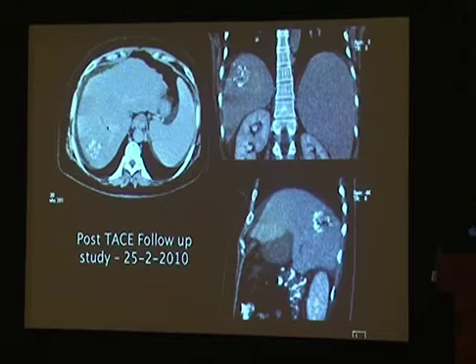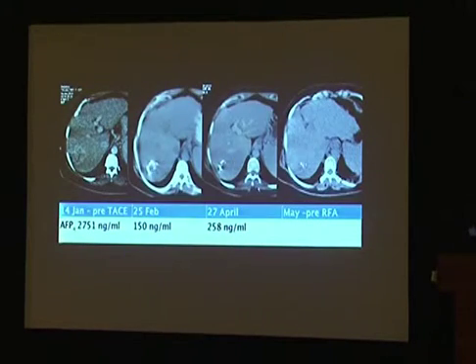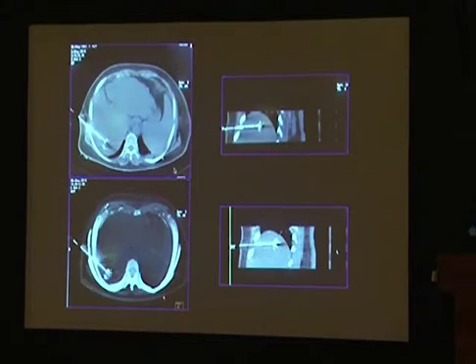We initially performed a transarterial chemoembolization in this patient, and on subsequent follow-up, what we found was the alpha-fetoprotein, which was raised initially, had significantly dropped to almost 150, and then however on subsequent follow-up, there was a rising trend, and it was at this point of time we decided to put in a radiofrequency ablation because the tumor size had significantly reduced to less than 3 centimeter in size. And this is the ablation, the intercostal approach here, the needle with the umbrella-like tines, multiple tines coming out.